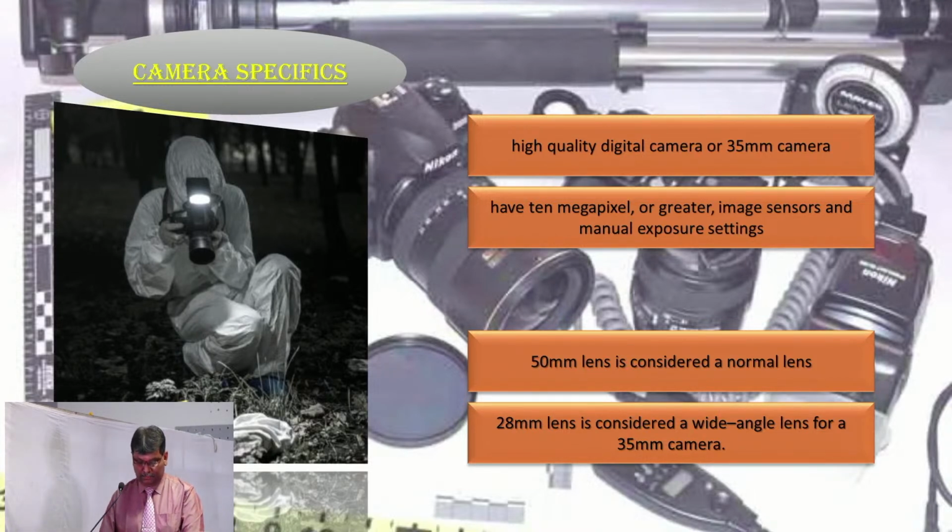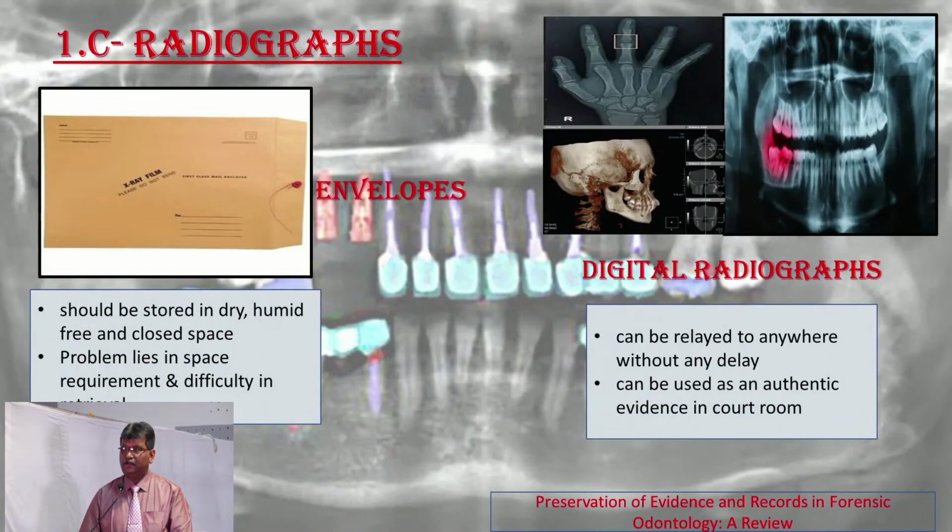And the camera specifications: a lot of cameras are used in this. It's not an Android mobile. Yes, there are certain things where we can use it, but in most instances we use DSLR cameras, which have certain specifications for what we are going to use them for.